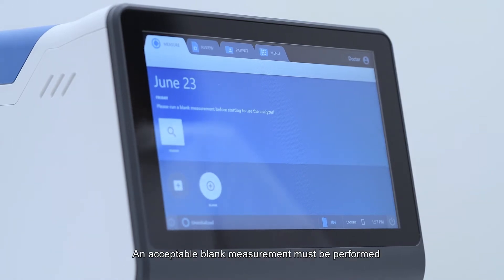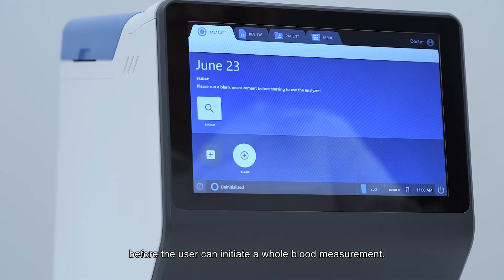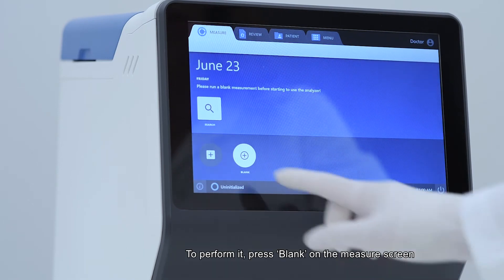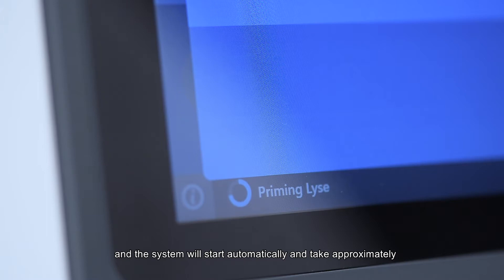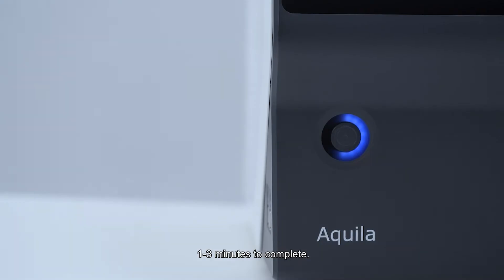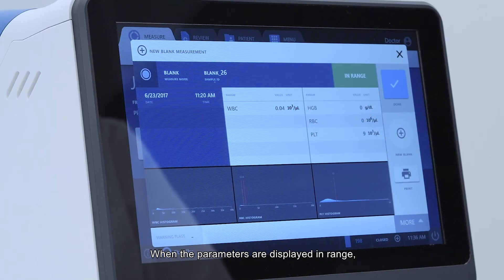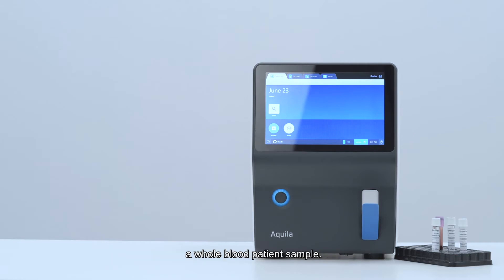An acceptable blank measurement must be performed before the user can initiate a whole blood measurement. To perform it, press blank on the measure screen and the system will start automatically, taking approximately 1 to 3 minutes to complete. When the parameters are displayed in range, press accept and the analyzer is now ready to measure a whole blood patient sample.